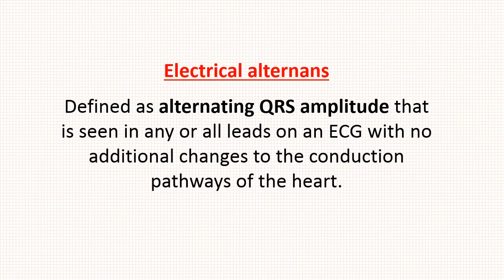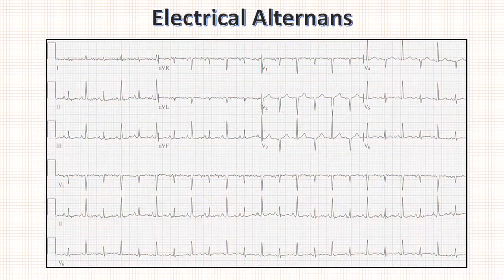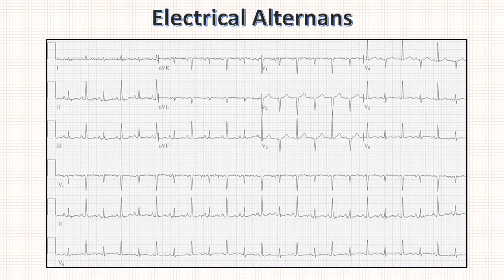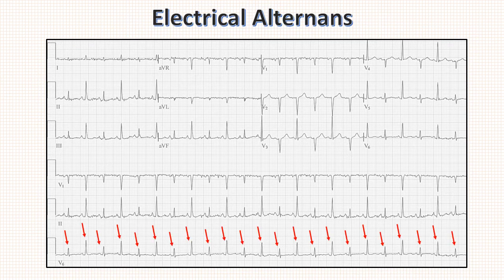First of all, what is electrical alternance — how to define it? It is defined as alternating amplitude of QRS complex that is seen in all leads with no additional changes to the conduction pathways of the heart. As you can see in this ECG, the amplitude of QRS complex varies beat to beat, and this pattern is known as electrical alternance.